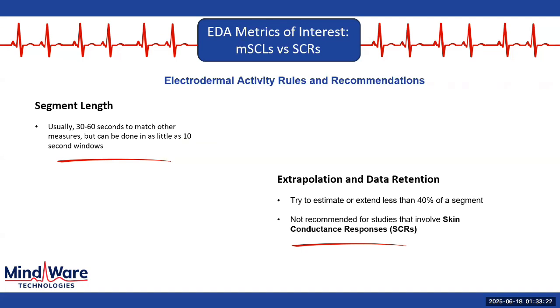As you'll see here as I'm going through these different examples and showing techniques, and even during the Q&A portion here, there's just less activity around it as far as rules and how we should edit these data. There's a wide variety of different techniques that people have available out there in the research atmosphere. And so it's a little bit difficult in some cases to find which one we should stick to.